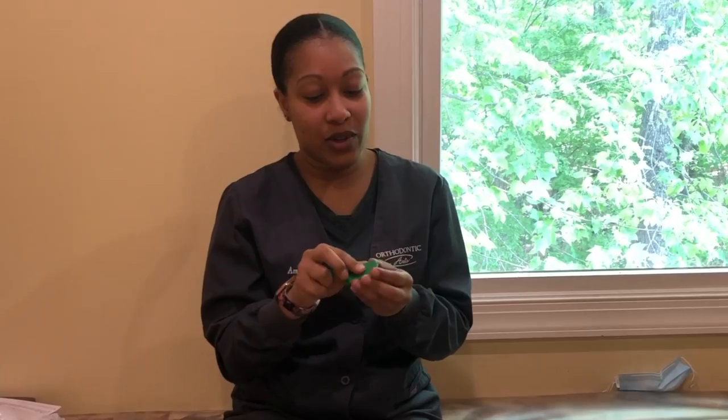We have two different types of wax that we give you. One is a silicone — it's clear in color and it's easier to use. And then we also have a more hard sticky wax that stays on a little bit better.